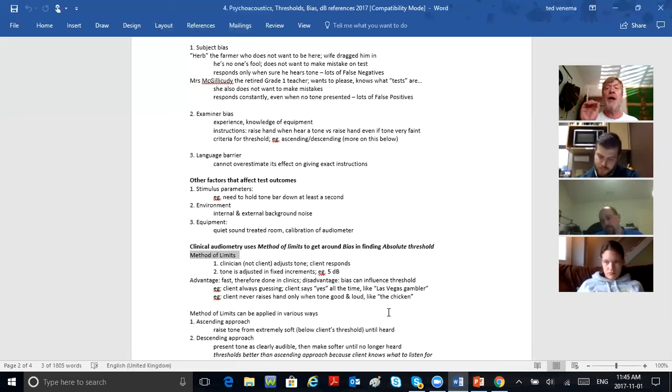Go down by 10 to 45. Did he hear it? No. Up by 5 to 50. Did he hear it? No. Up by 5 to 55. Did he hear it? Yup. That's threshold. Two ascending yups at the same dB level.